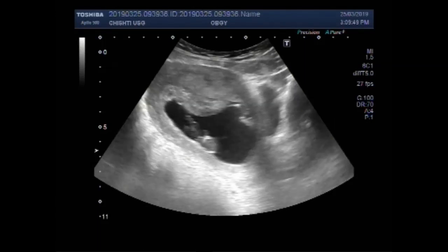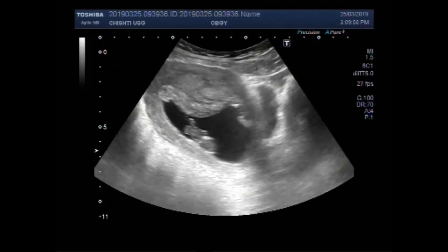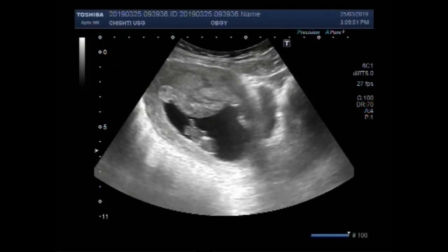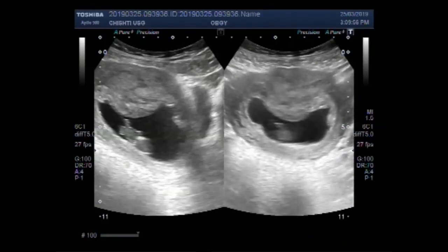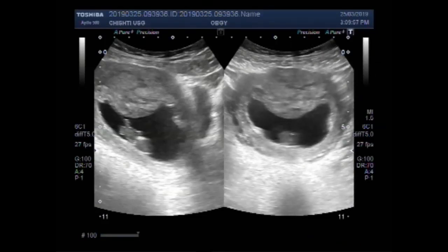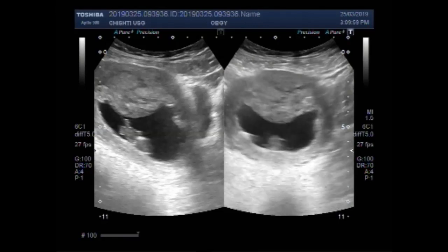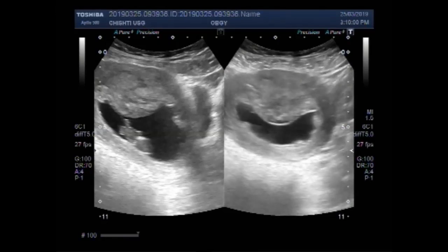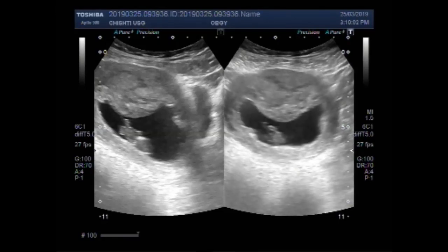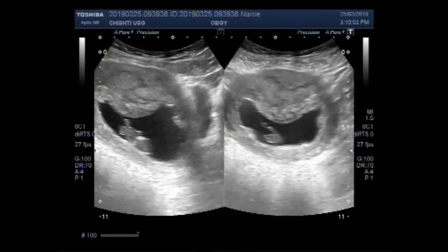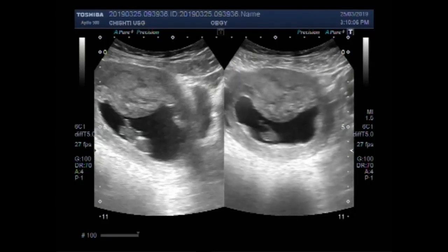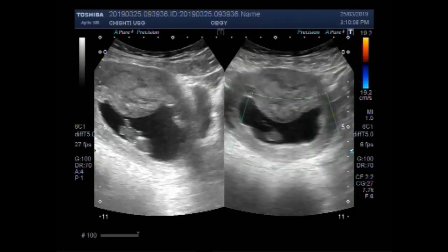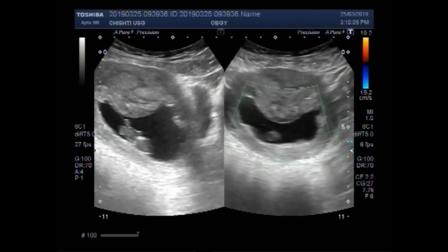This is an intrauterine pregnancy with fetal demise. The fetus is normally placed inside the gestational sac, but no blood flow is visible and there are no fetal movements.